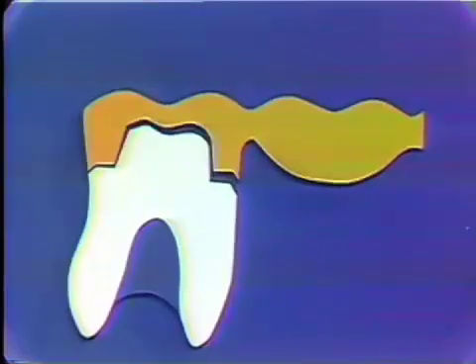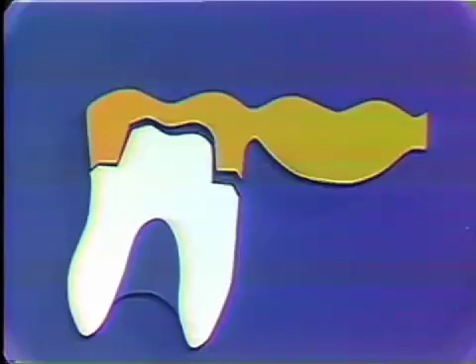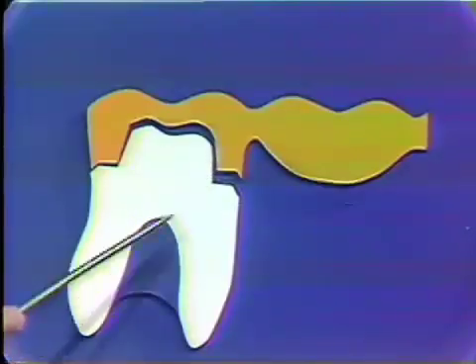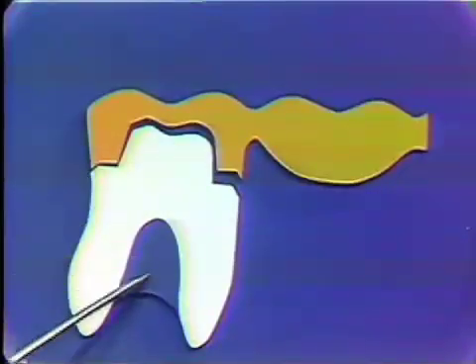The anterior component causing the forward movement puts stress on the cement lute around this situation here. In this particular retainer, which has a fairly short clinical crown and marked taper of the distal and mesial surfaces, this tooth can move out of the gold restoration, pivoting about this point as the tooth rotates on its fulcrum down here.